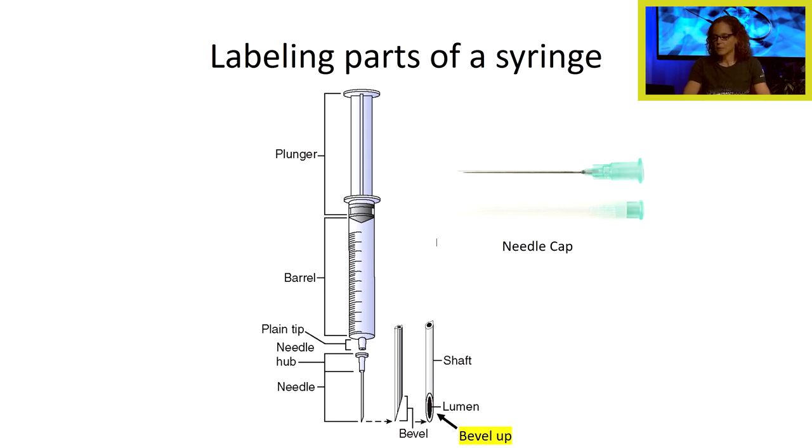Let's label the parts of our syringe. We have a plunger; the part where we draw medication up into is called the barrel. We have a plain tip, a needle hub, our needle, and the needle is beveled at the end — the lumen of the needle is beveled. Some injections require the bevel facing up. We also have a needle cap for safety purposes — we can recap the needle on our way to give an injection. Note that this particular needle does not have a safety glide; some needles have them and some do not.